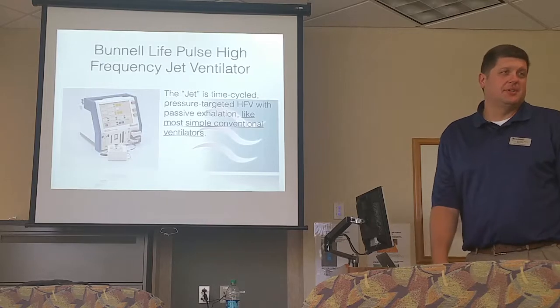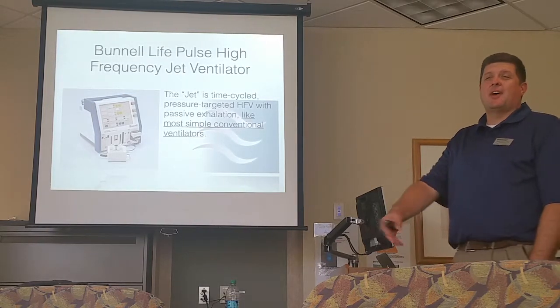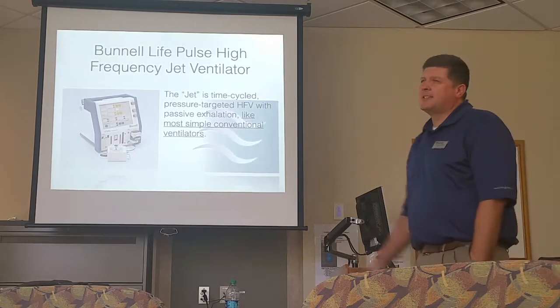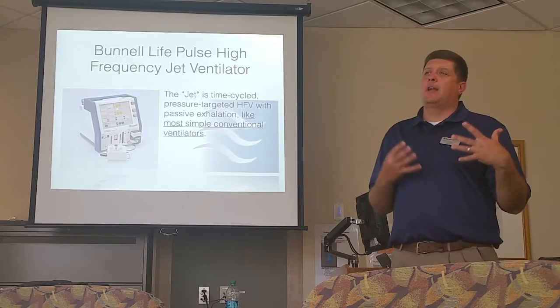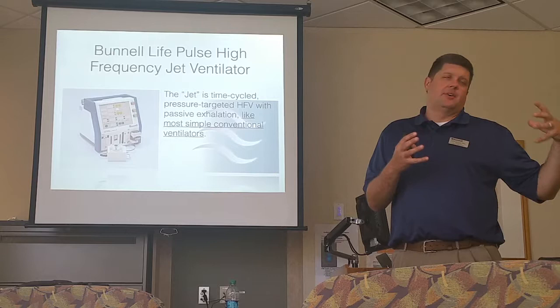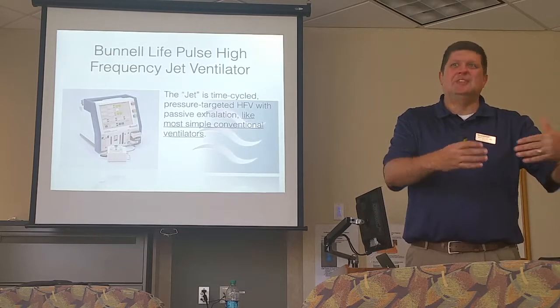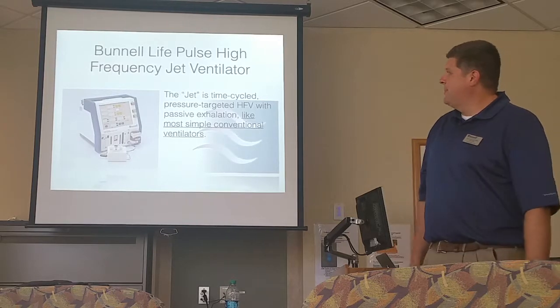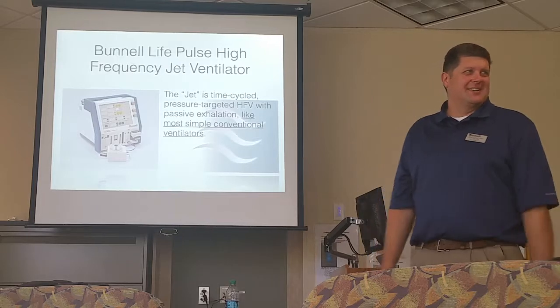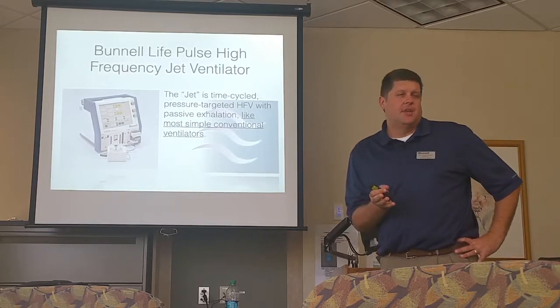So the jet ventilator. This picture I threw in as a fun little Easter egg. That's what the new jet will look like next month when it's released. It's half the size and half the weight of the current model. It has a few extra things. It's not what a lot of us want, the built-in one with the conventional and the blender and stuff like that. This is the intermediate step to get us to the jet that we all really want. But it's cute, it's fun, and I can legally talk about it now, so I threw it in there.